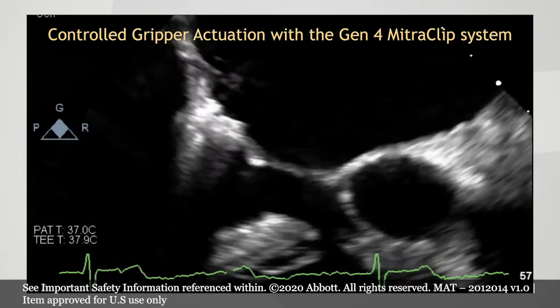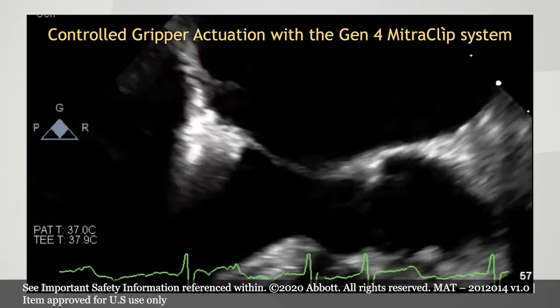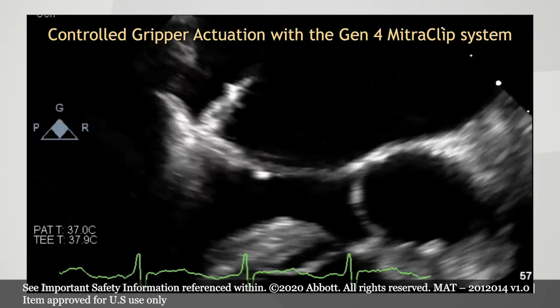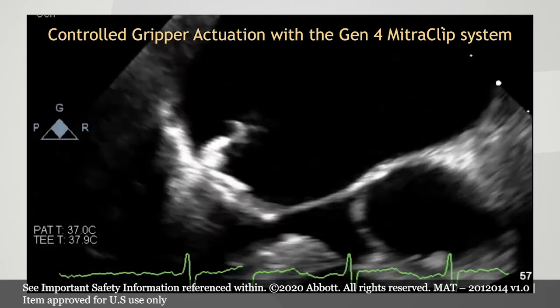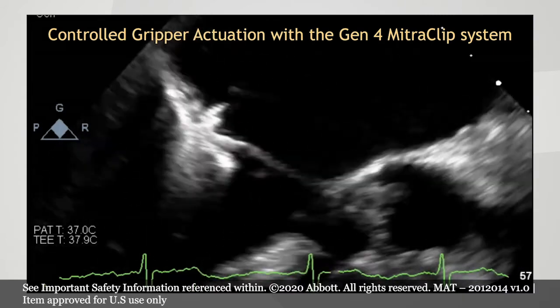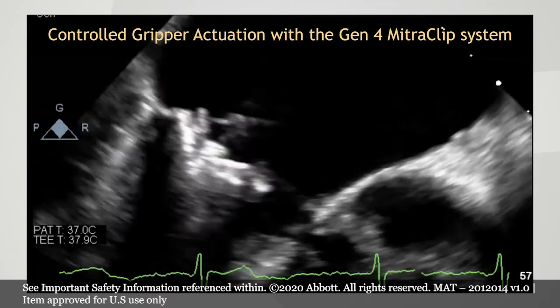And then ultimately the gripper is coming down and we seem to have a nice sandwich there as well. Get that posterior leaflet in here. It's showing it again one more time. Certainly paying close attention to posterior now while we have the clip move towards the posterior annulus to accomplish the grasp.